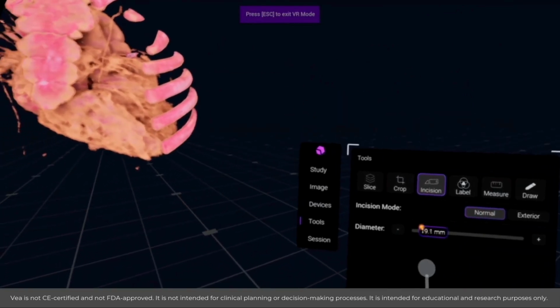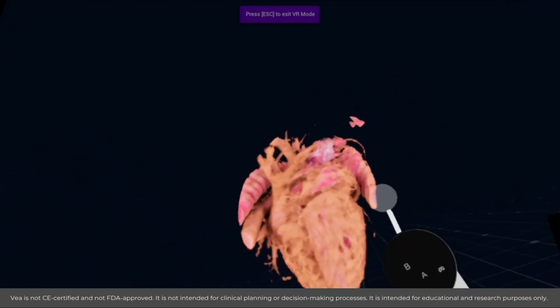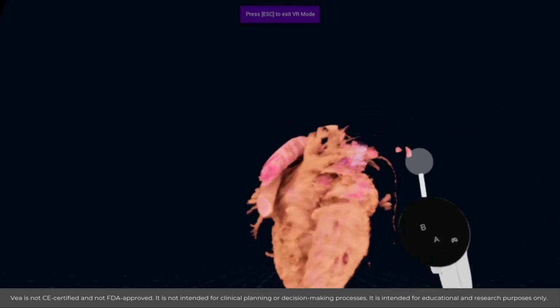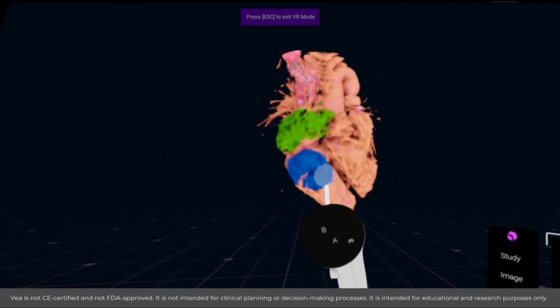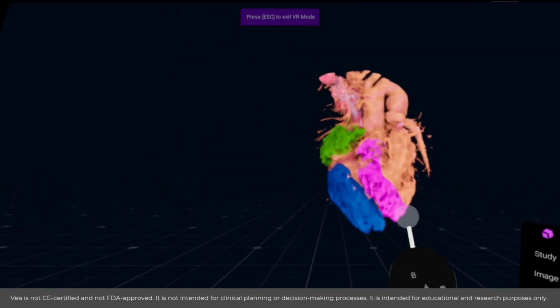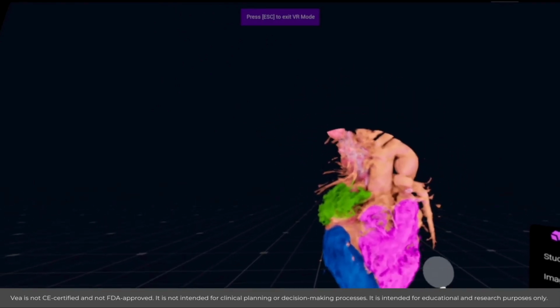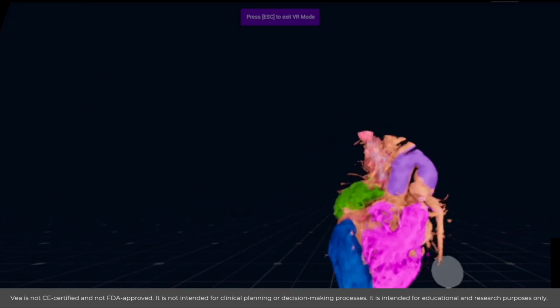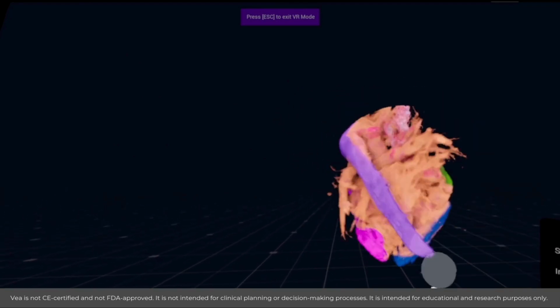This is a 3D VR rendering of the cardiac CT. We are preparing the specimen by removing all the skeletal structures, and that's the right atrium connected to the left ventricle. This is the right ventricle that gives rise to both great arteries. That is the aorta and the descending aorta. This is the PA banded area.